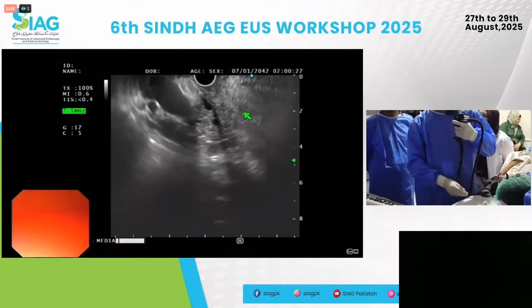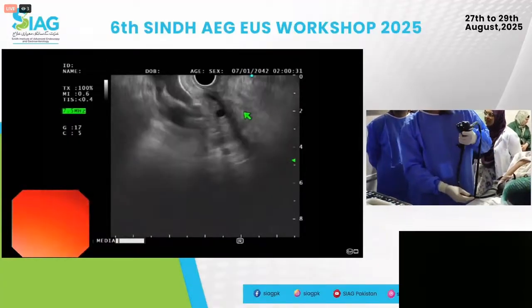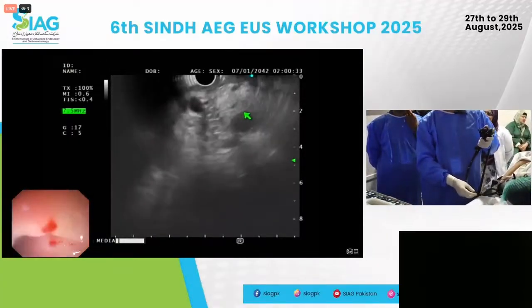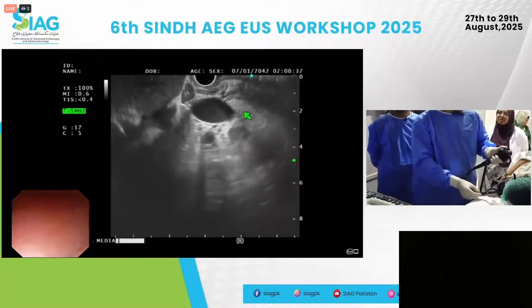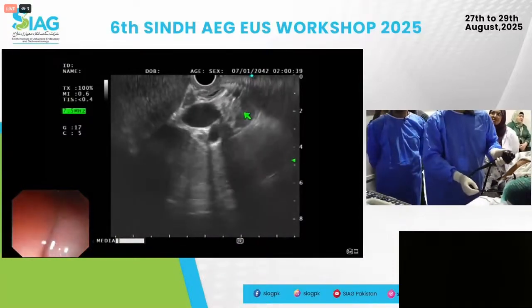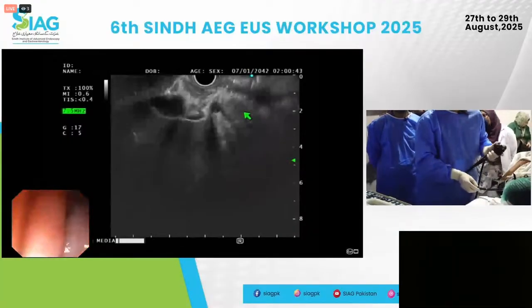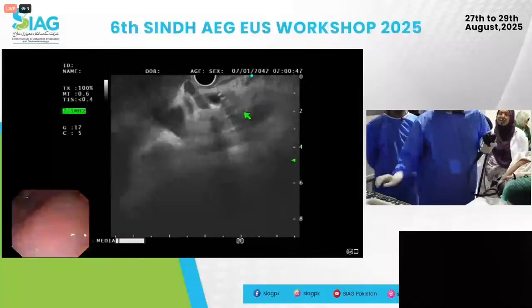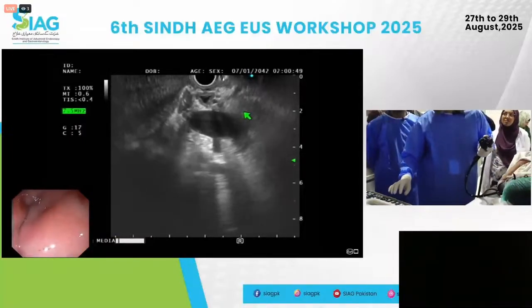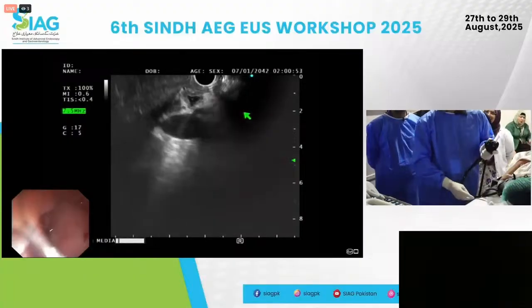I mean, the first thing that crosses my mind is if we completely clear the duct. Right. I assume she doesn't have a gallbladder. Yeah, she's post-cholecystectomy from 2008. The walls, obviously because of the stone and I'm sure infection, the walls are a little thick. A bit enhancing, I think, yeah. But diffusely enhancing, it's not irregular in nature.